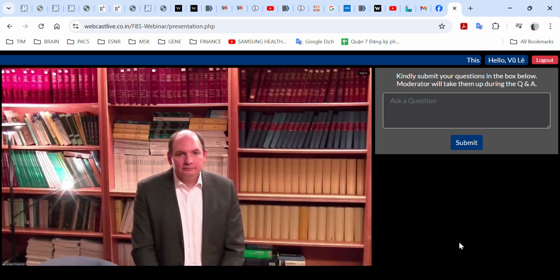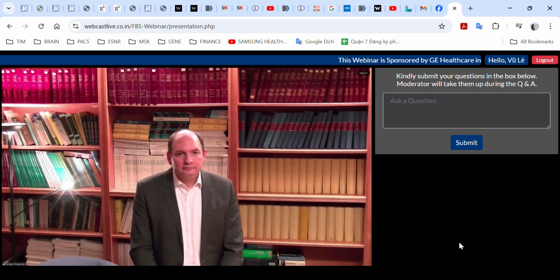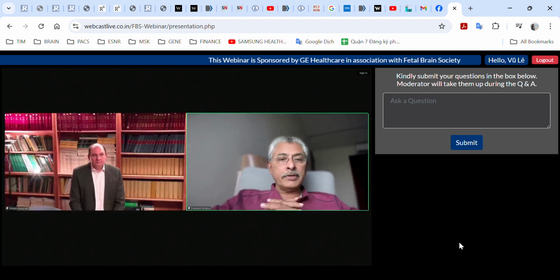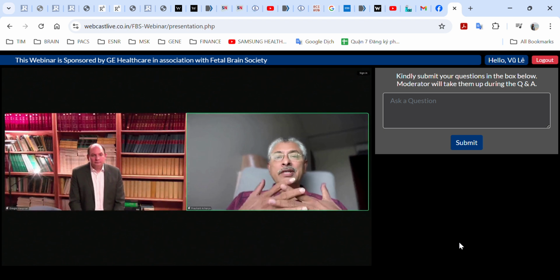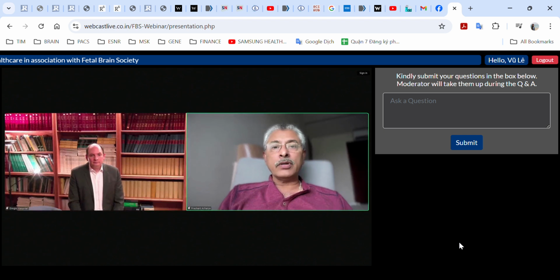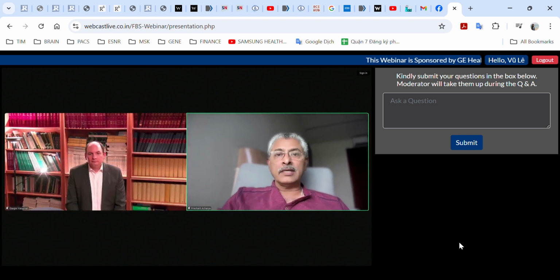Thank you, Gregor. Brilliant images as usual, and unbelievable MRI and the follow-up. It's not only tractography, but the follow-up and relationship of hemorrhage, what kind of restriction it can lead to, and what kind of white matter injury it can lead to, and how to detect them, and how to prognosticate. As you said, uncertainty still prevails. You cannot be certain in all the cases, which you showed in your last case.